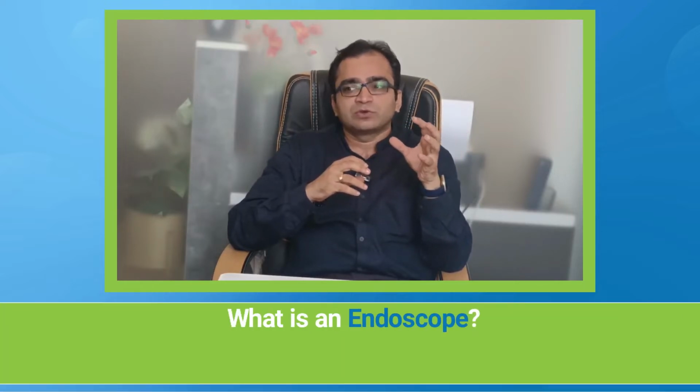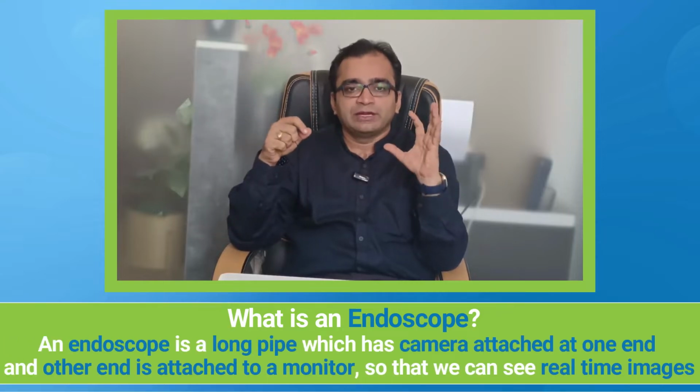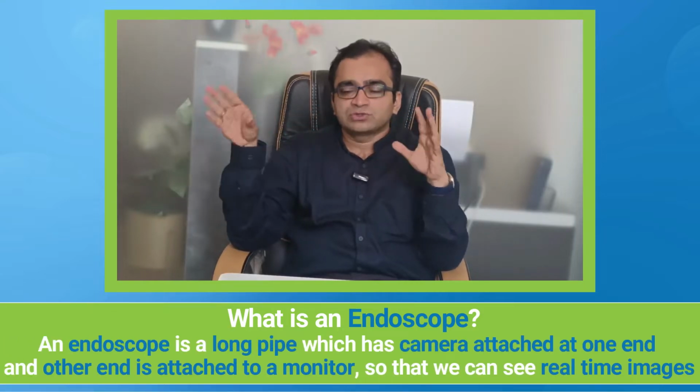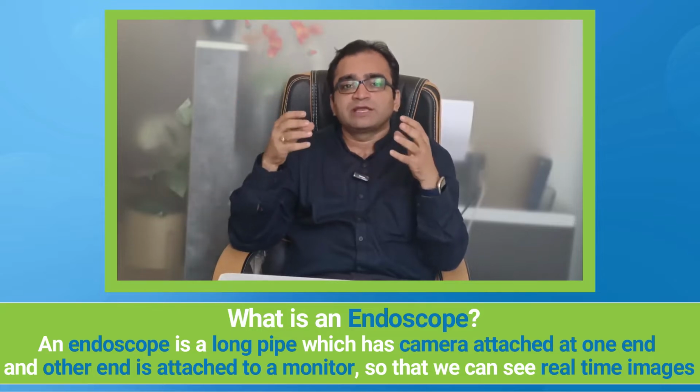So what is an endoscope? Basically, an endoscope is just a long pipe which has a camera on one end and the other end is attached to a source or a monitor, either a computer or any other monitor, so that we can see and take real-time images. And it obviously has software so that the images are uploaded in a particular fashion.